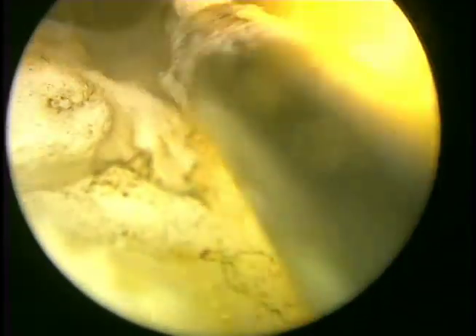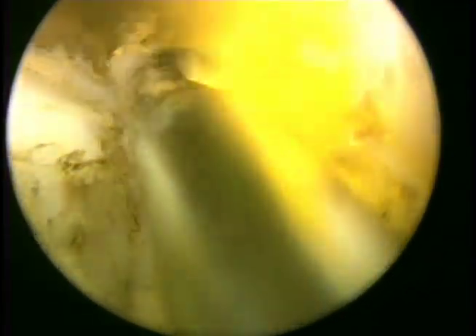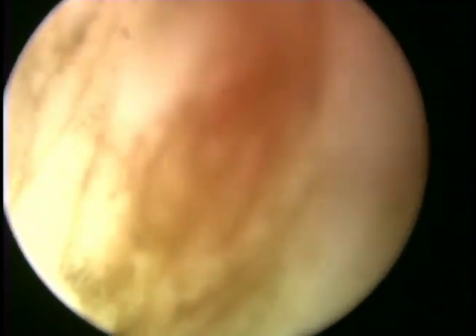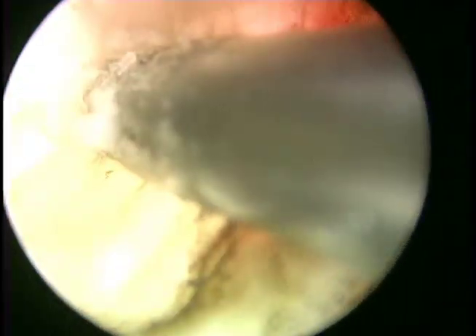We can now start appreciating the sulcus formation at the 5 o'clock area. This is simply from the concave to the more convex deep opening that occurs, and simply the passage once again of the fiber, like a small laser knife, to open up and dig deeper toward the surgical capsule.